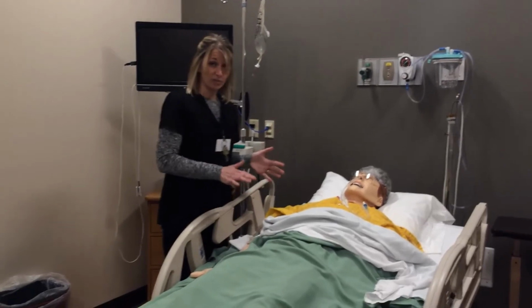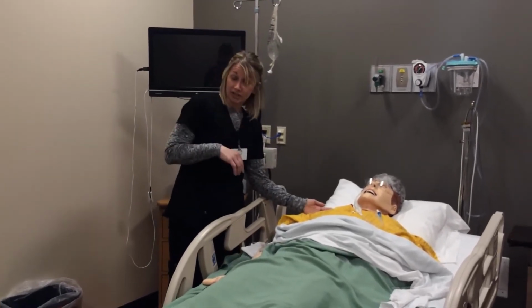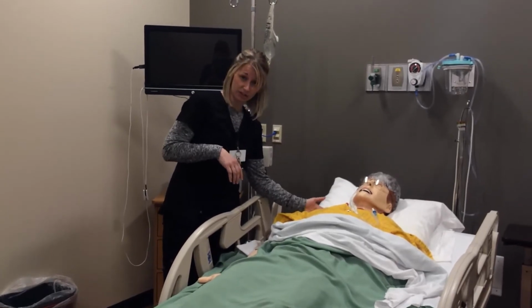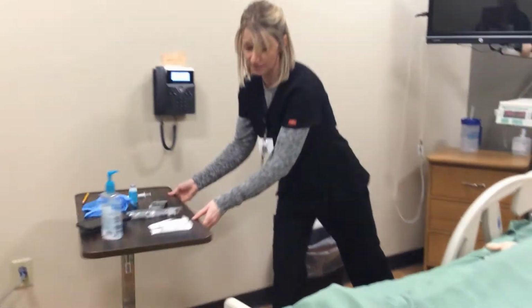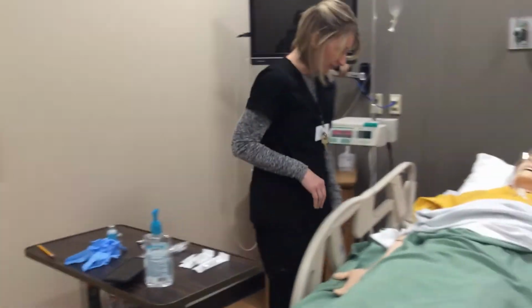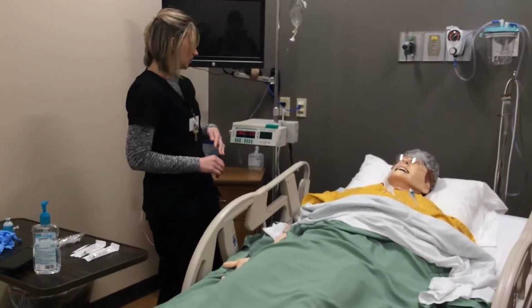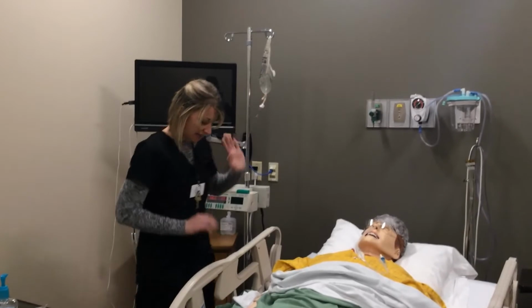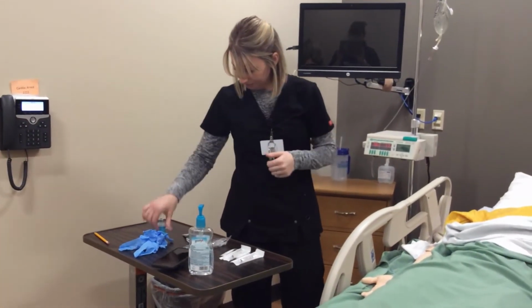All right, so I do my appropriate assessment to what I'm going to give. Since I already know I'm going to give Solumedrol, I went ahead and listened to his lung sounds as well. So for this first demonstration, let's say that I am going to give the morphine through a running line that is compatible. Okay, you've got saline running, and I'm going to give morphine. I check the compatibility in my drug book, and it is compatible.